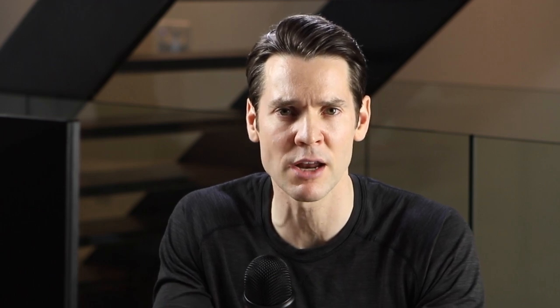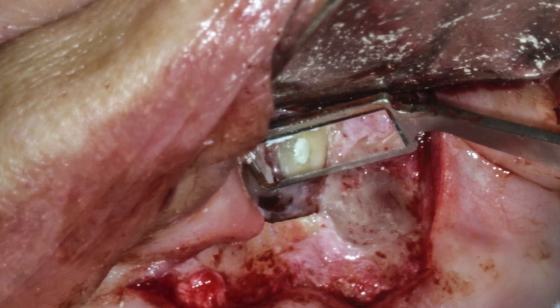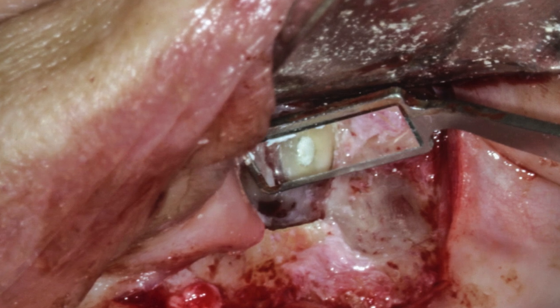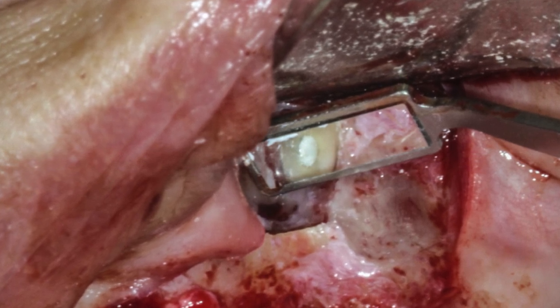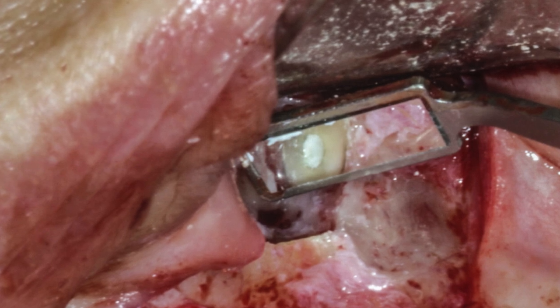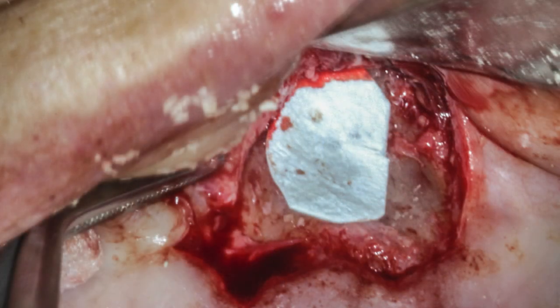We prepare this area with ultrasonics and remove as much of that contaminated material as we can. Once that canal system is as clean as we can get it, we seal off that apical area with a bioceramic material. In this particular situation, I chose to use a bioceramic putty-like material because it was easier to handle. I'll typically graft all of my sites — I'll use a little bit of DFDBA and place a membrane over it to protect it.